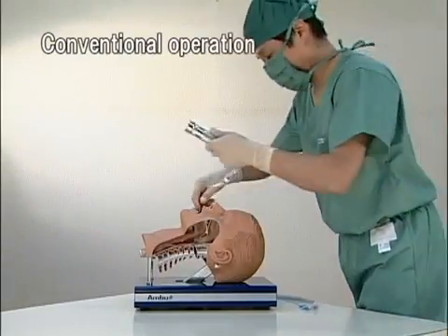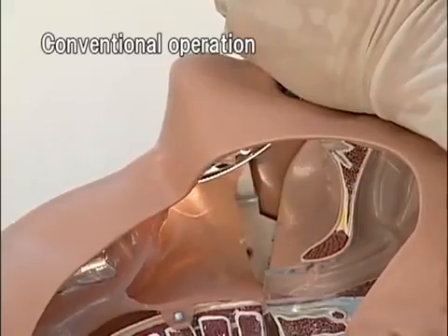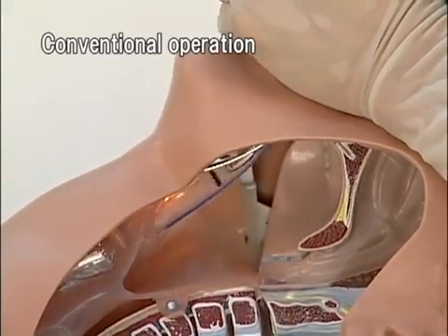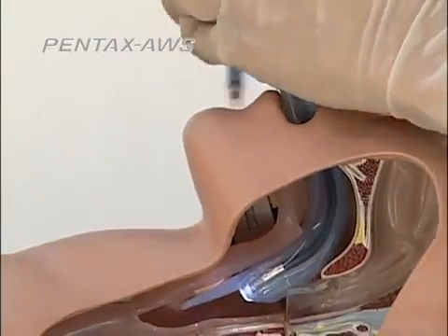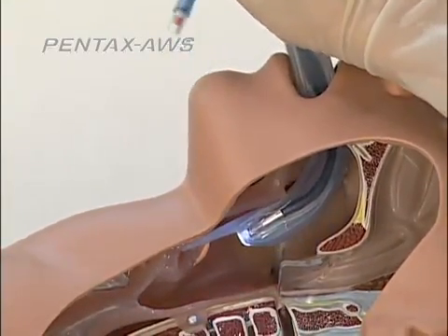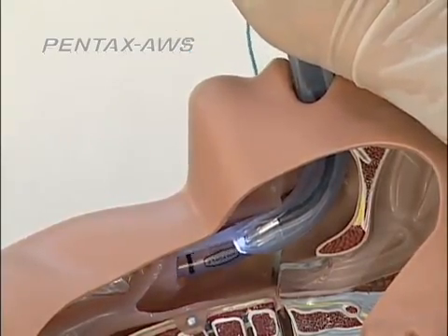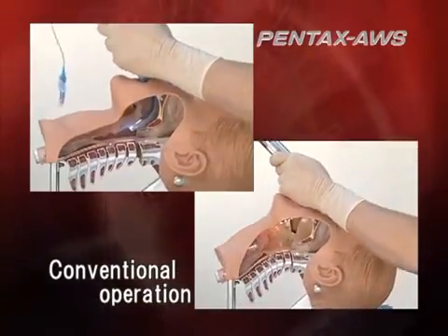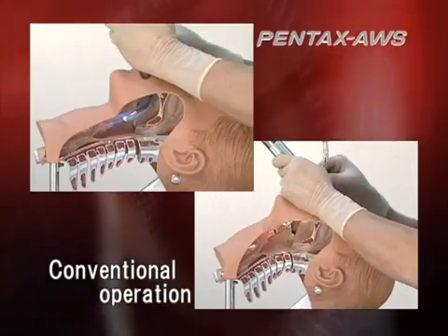When intubating with a conventional laryngoscope, you insert the tip of a blade into the vallicular, raising up the lingual radix anteriorly. With Pentax AWS, place the scope under the epiglottis and confirm the glottis by slightly elevating, without forcing. Compared to conventional laryngoscopes, Pentax AWS eases the stress on the patient.